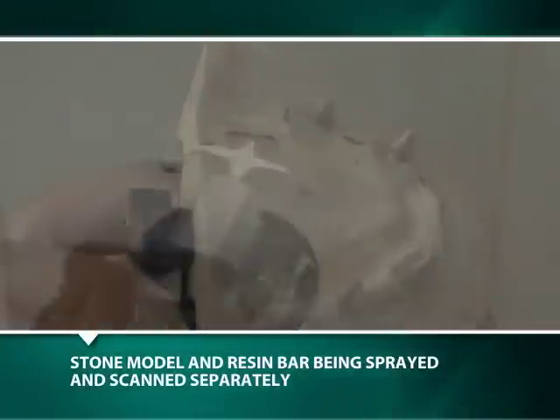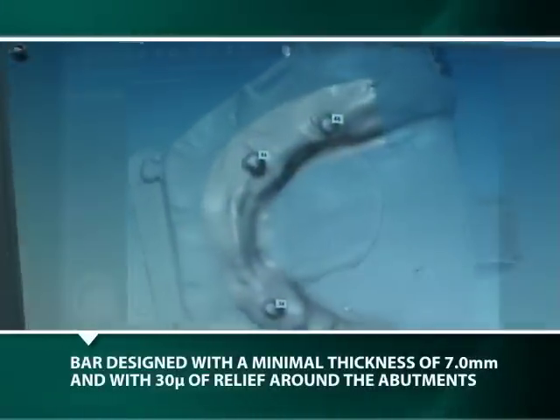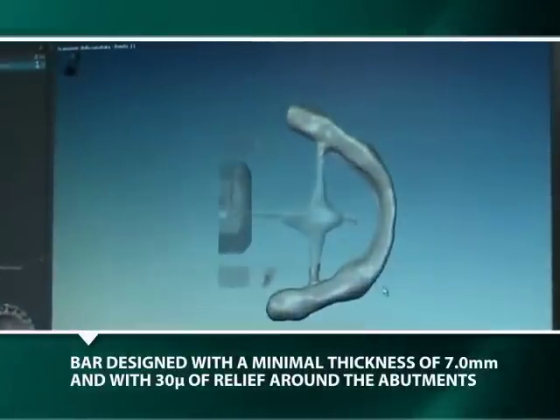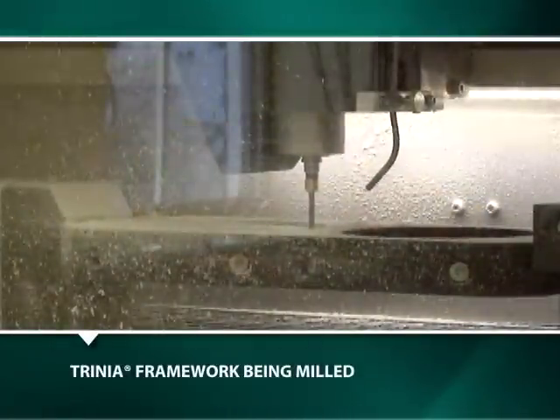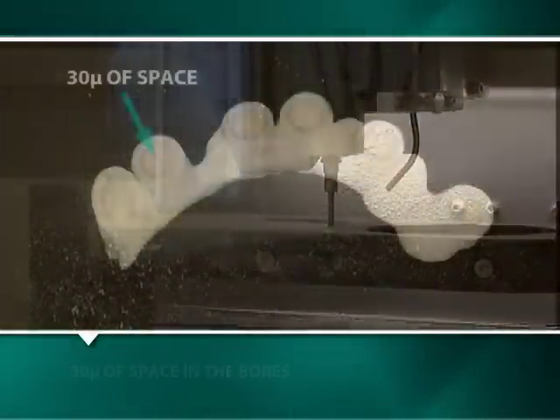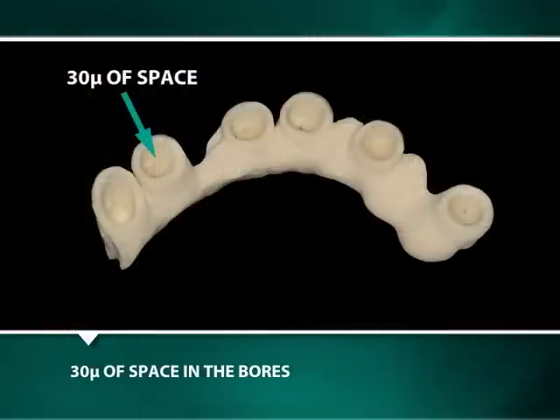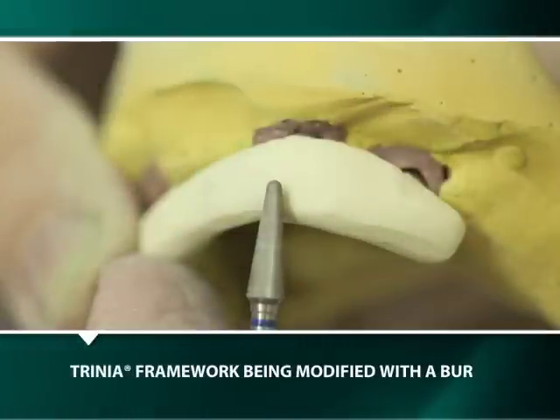After the model with the milled abutments and the resin bar are separately sprayed and scanned, the TRINIA fiber resin bar is designed digitally on the computer with 7 millimeters of thickness throughout, with an abutment clearance of 30 microns for cement, and with a maximum cantilever extension of 21 millimeters. If necessary, the milled TRINIA framework may be judiciously reduced manually.